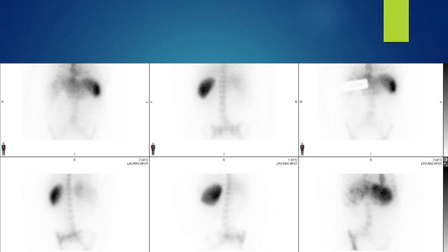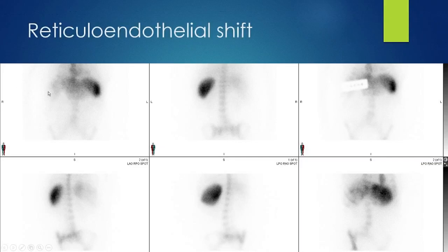Here is reticuloendothelial shift: the liver is markedly down relative to the spleen, and we see a lot of bone marrow activity. This patient had infiltrative liver disease as well as thrombocytopenia. The increased activity within the spleen may be the cause of the thrombocytopenia due to increased reticuloendothelial system activity.